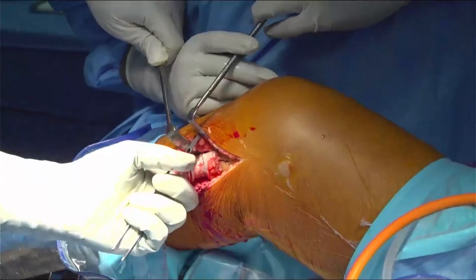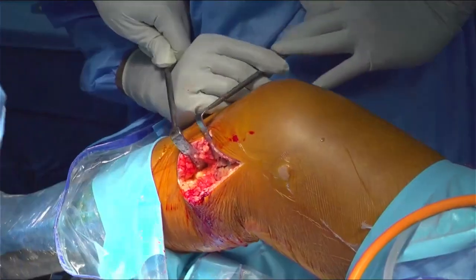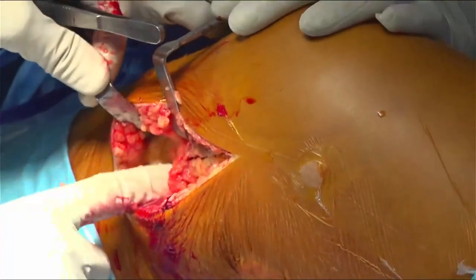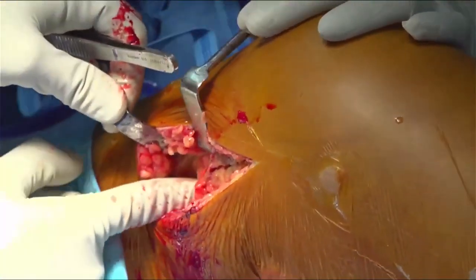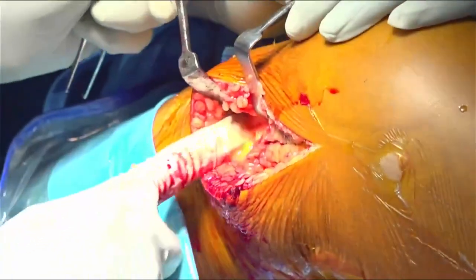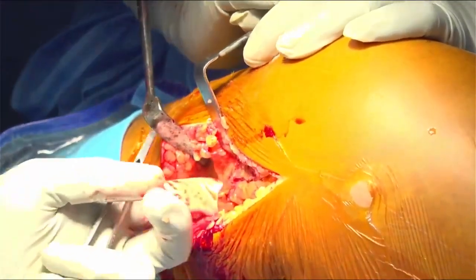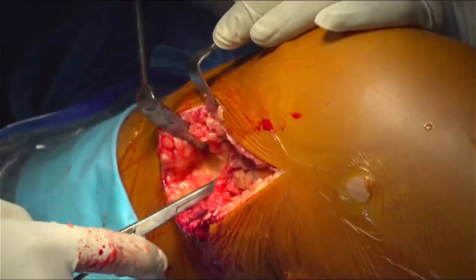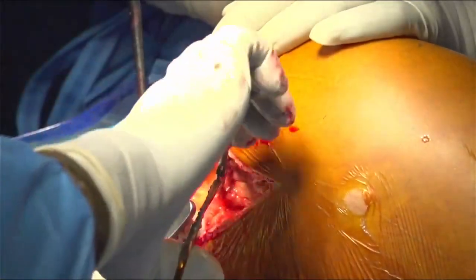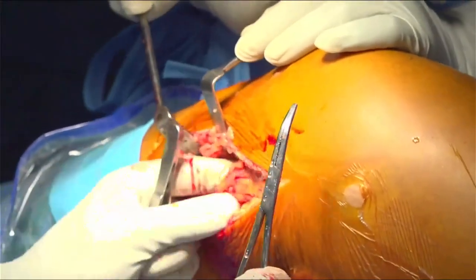Okay, so now, this is basically the stump of the MCL. We need to identify. So what has happened is the MCL is avulsed and it has gone above the original insertion of the MCL. So here, if you can appreciate, this is the level of my tendons, and you can see that this is the level of my MCL area which is torn.